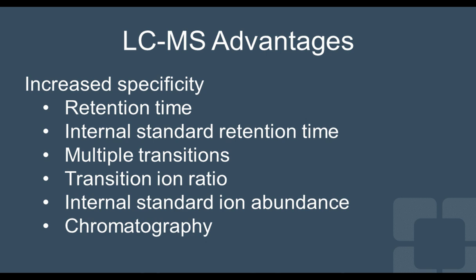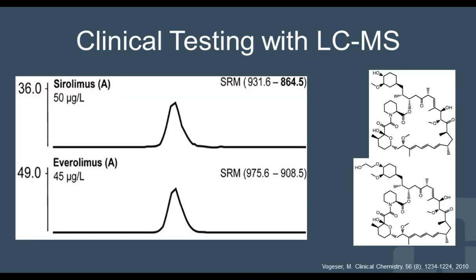The chromatography can be reviewed for peak tailing, peak fronting, split peaks, multiple peaks eluting, potentially causing interference with your measurement, which can be reviewed. All of these are viewable versus an immunoassay, potentially, where you may be able to see a reaction monitor, but ultimately you're just producing a signal from a secondary interaction with the antibodies.